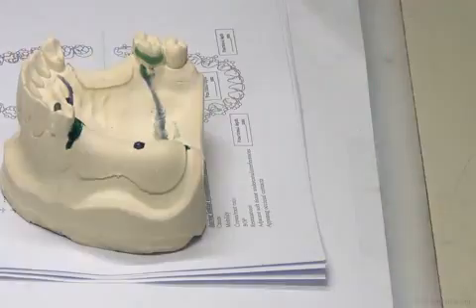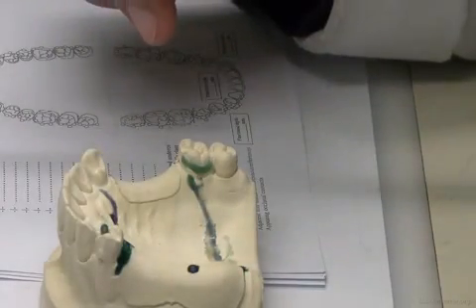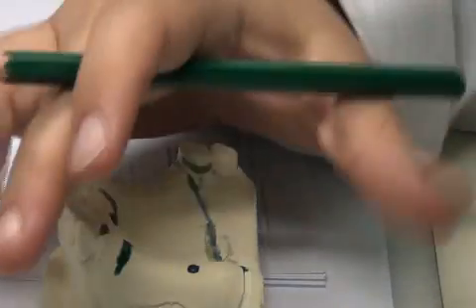The cast comes, the patient comes and I took an impression. This is the cast there. Okay, what are we going to do to this cast? One of the steps is surveying. This is an initial step.